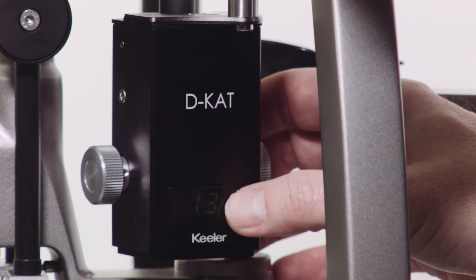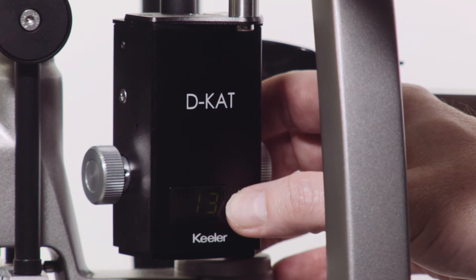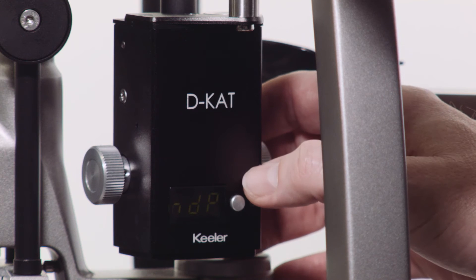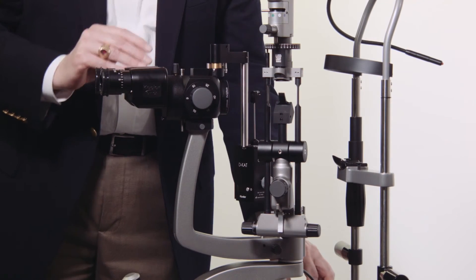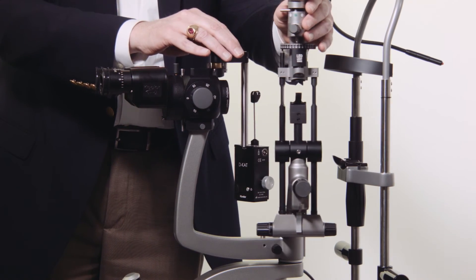The D-K-AT features a display that allows you to read IOP measurements in dark environments. The D-K-AT mounts the same way as the K-AT and operating principles are identical.